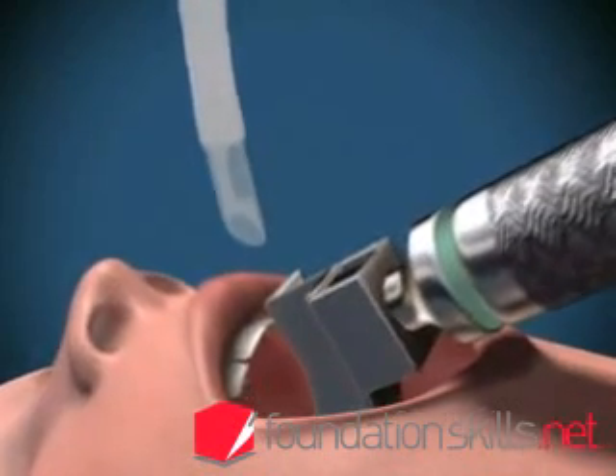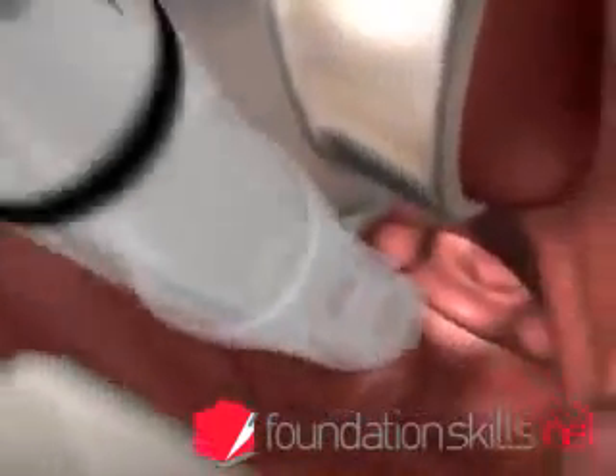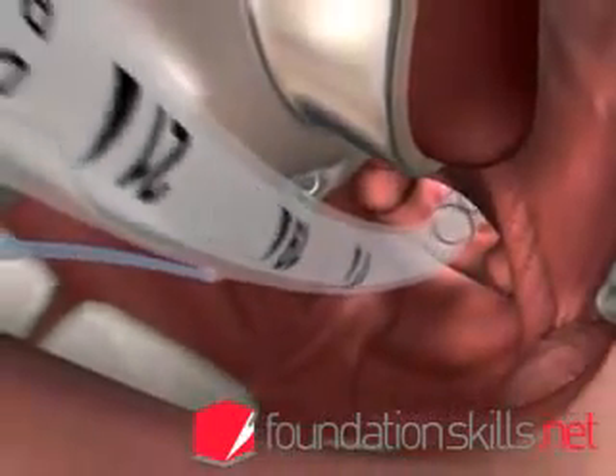With the right hand, insert the endotracheal tube from the right hand side of the mouth directly between the cords and into the trachea until the cuff passes through the cords.